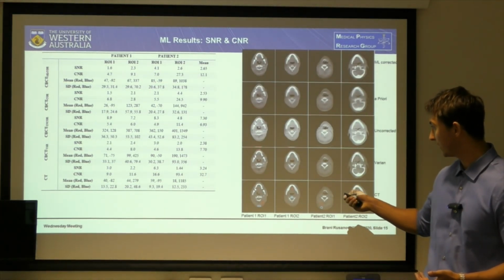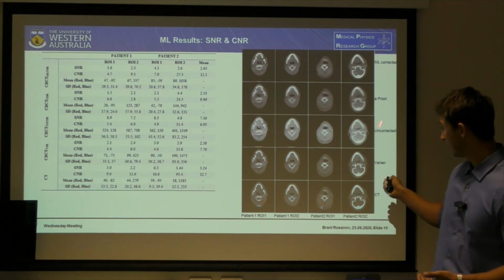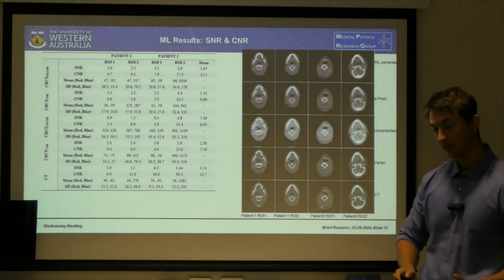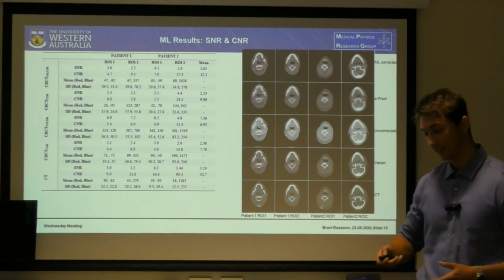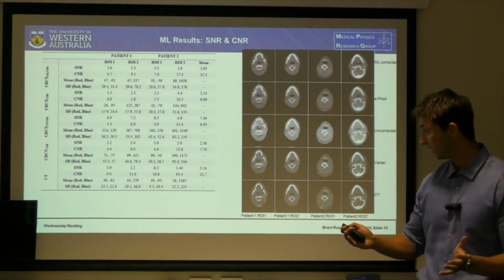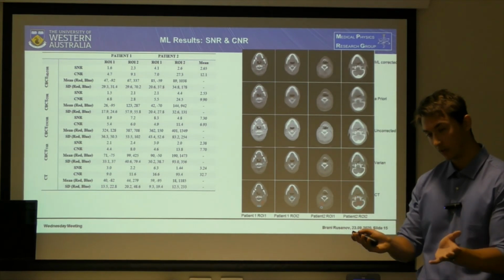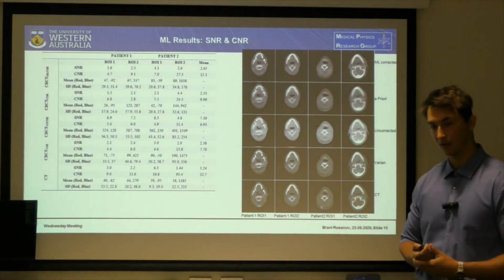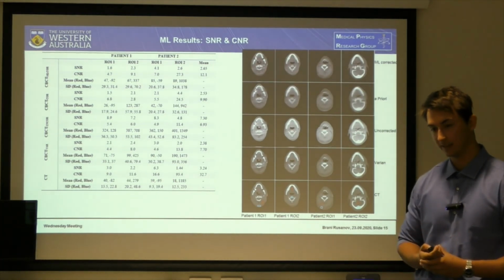So you might see a ring that's present here. I've omitted some slides, but when I reconstructed the pelvis, it vastly exceeded the field of view, and you get enormous ring truncation artifacts. But thankfully for the head and neck scans, we don't get that because the field of view is larger than the head.